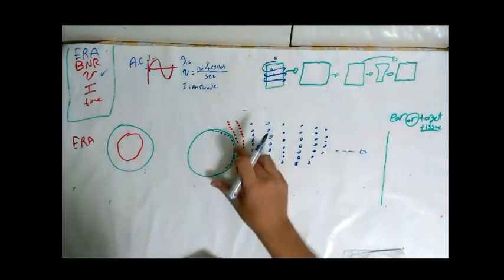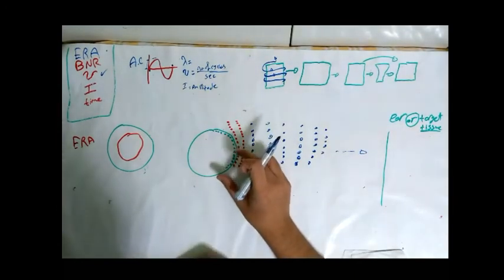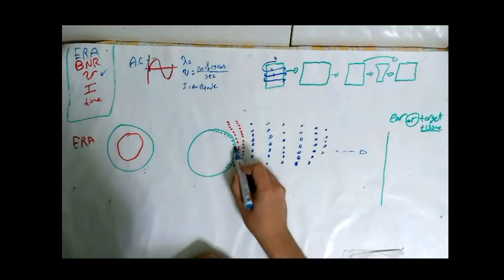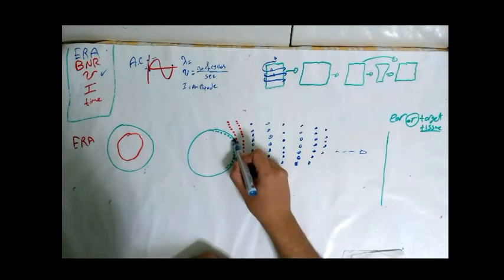So when the ultrasound crystal or speaker in headphone expands, it will push these molecules or atoms forward.